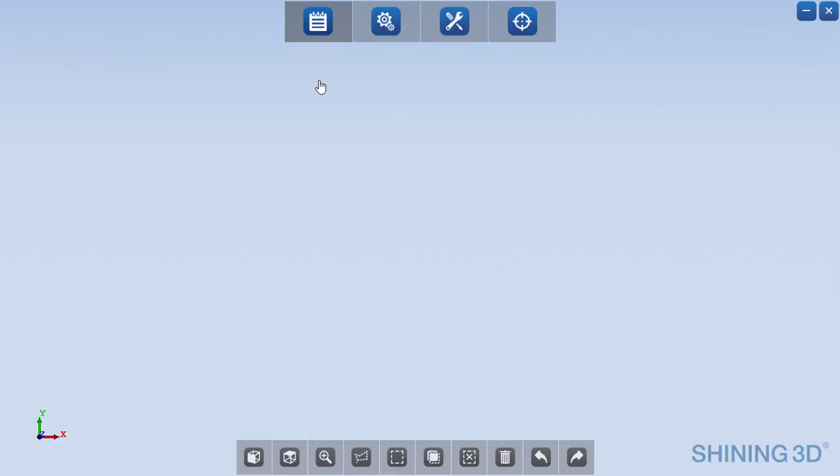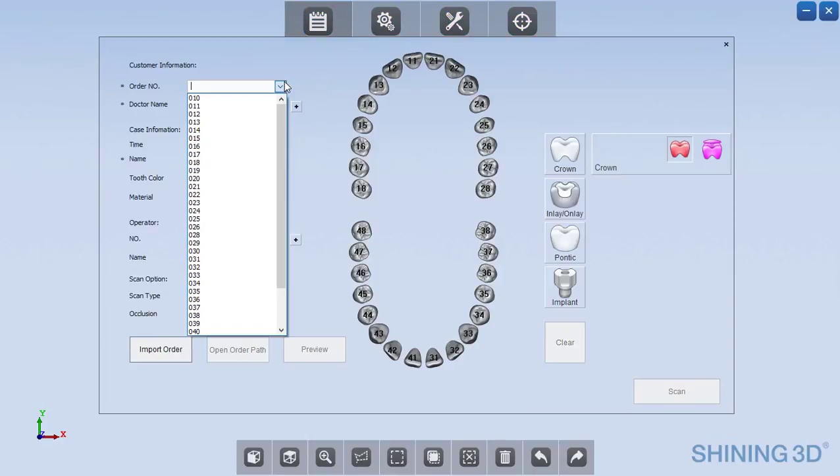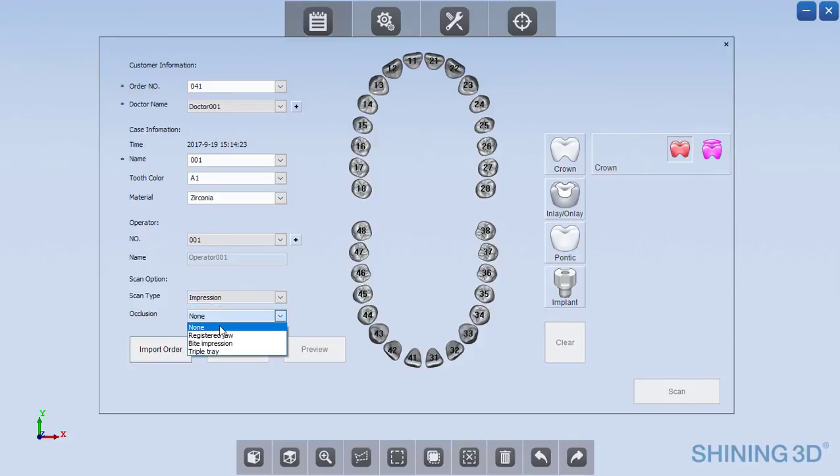I'm going to be showing how you would go about scanning a triple tray impression with the DSEX scanner from Shining3D. So I'm going to name the order number and this is going to be an impression and it's going to have triple tray as the occlusion type.